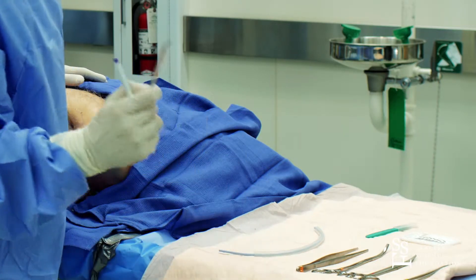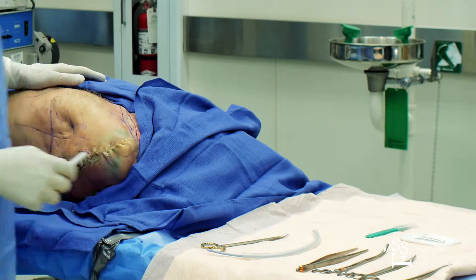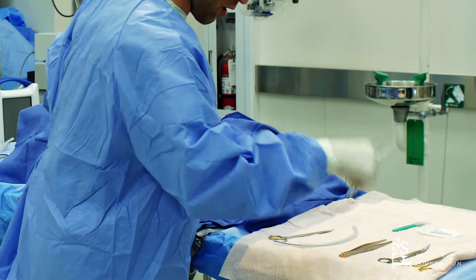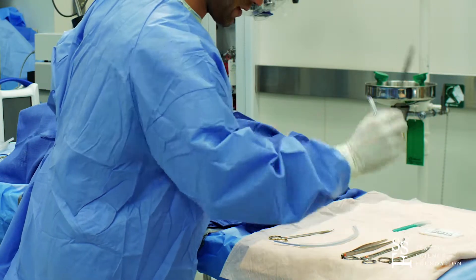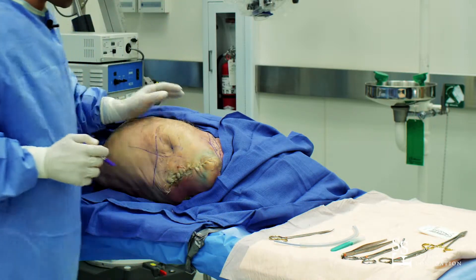Furthermore, we need a Metzenbaum scissor, a chest tube — it's always better at the beginning to have two different sizes of chest tubes. We need something to lock the chest tube, something to suture it, and a scalpel for the skin incision.